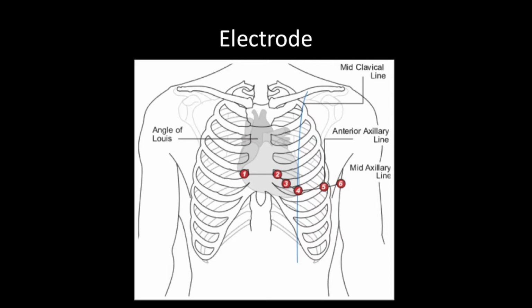If we go back here, it's exactly what it says, right? Okay. What about two? Directly across the sternum. Correct. Right across, same level. Boom. Other side of the sternum. No problem. Which one are we going to do next? 6? 4? We could. I usually do 4, but okay. Let's do 4. So, 4 gets applied in which intercostal space? Fifth intercostal space. So I need to know where 4 and 5 are.